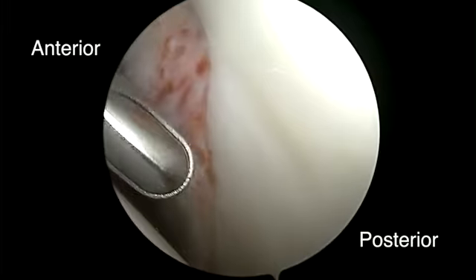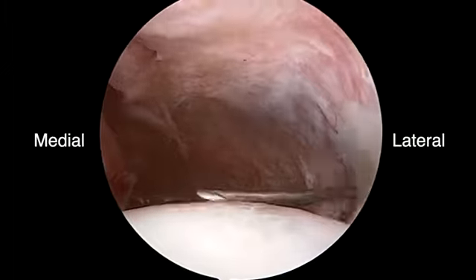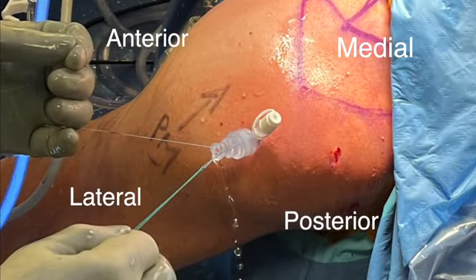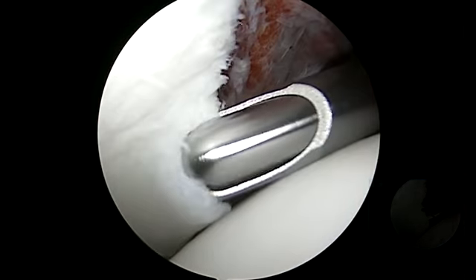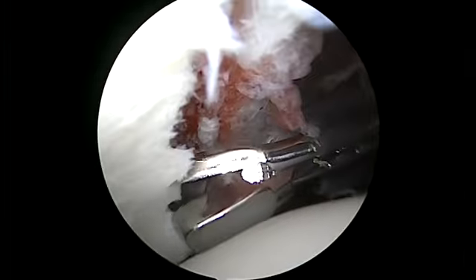The arthroscope is then moved to the anterior superior portal to view the posterior bony Bankart lesion. Using an 18-gauge spinal needle for localization, a posterior inferior portal is made approximately 4 cm distal to the posterior lateral corner of the acromion, and an 8.25 mm cannula is placed. Appropriate position of this portal is essential. The lesion is then debrided with a shaver and meniscal biter to create a smooth bony surface for healing and ensure a stable cartilage interface.